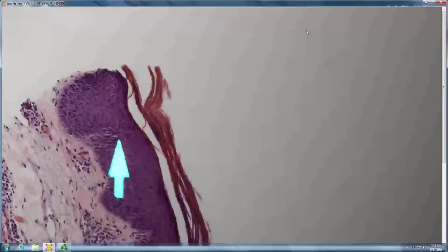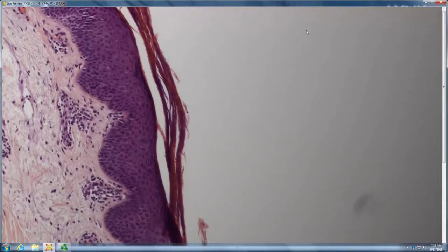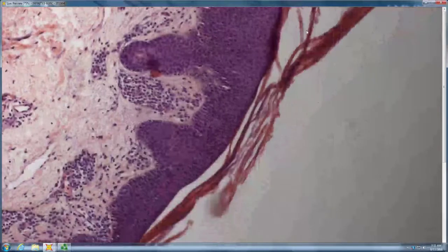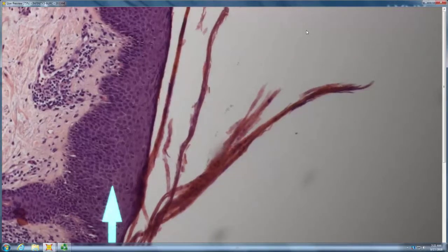Parakeratosis. Do you see much spongiosis? A little. Yeah, barely any. How about your suprapapillary plates? Thick or thin? Thick. So thick. And is there a little parakeratosis or a lot? A lot of parakeratosis. And an accompanying lot of spongiosis? Not really, right? So you have parakeratosis out of proportion to spongiosis, thick suprapapillary plates. What might you think of? PRP again. Yeah. So PRP, sometimes you don't see checkerboard. You just see lots of para. One of the clues is that the parakeratosis is out of proportion to the spongiosis. So it really looks papulosquamous rather than dermatitic, rather than spongiotic.